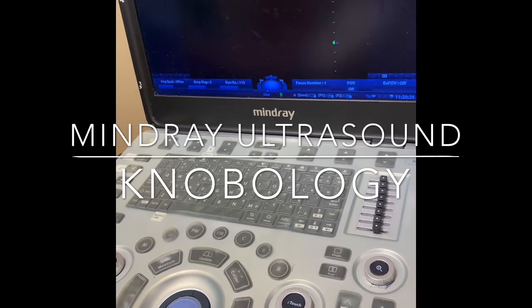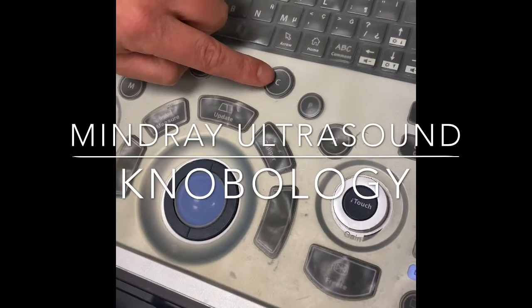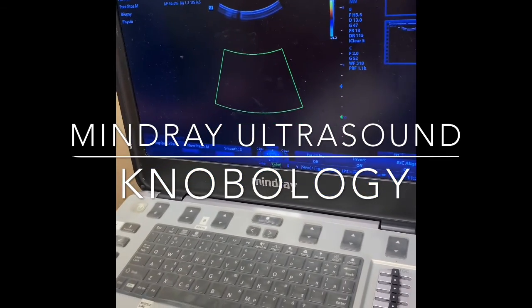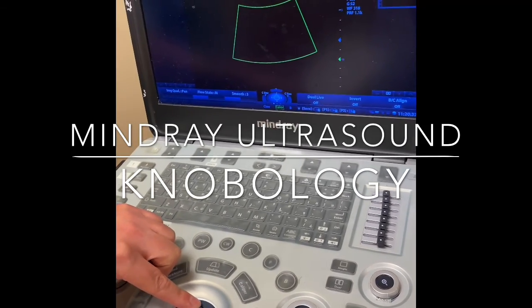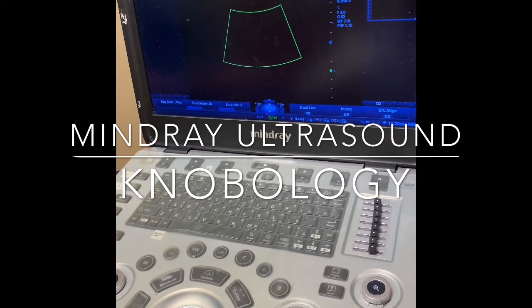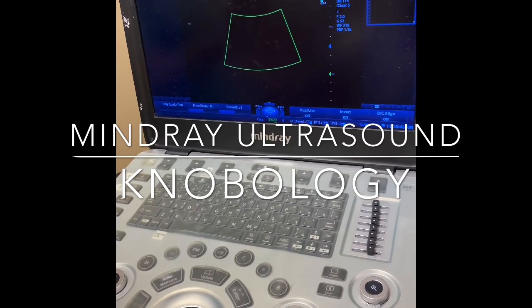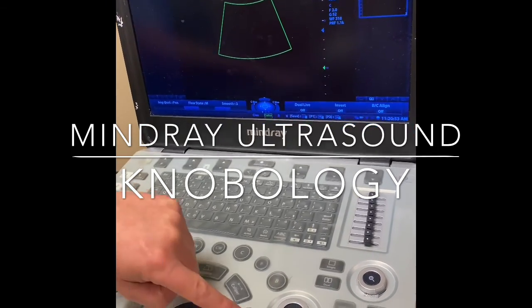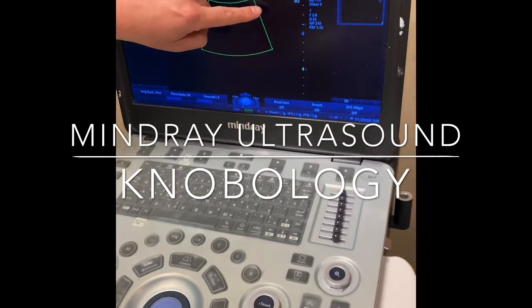One of the other functions that we commonly use is color flow. If you press the C button or color flow, you will see this green box appear on the screen. You can use the trackball to move it around. This, just like it sounds, is used to identify color flow within a vessel or structure. For example, if you're looking at an abscess, to see if there's any vessels there. If you're looking at a lymph node to identify that that's a lymph node versus a non-vascular structure, you can use this.